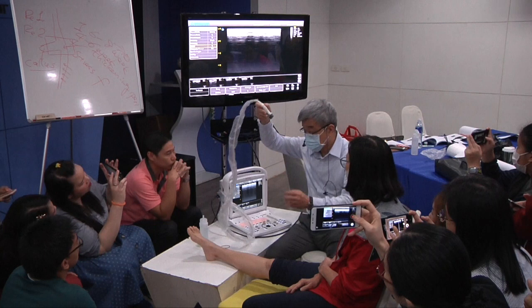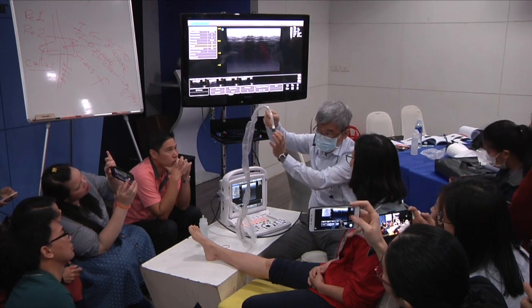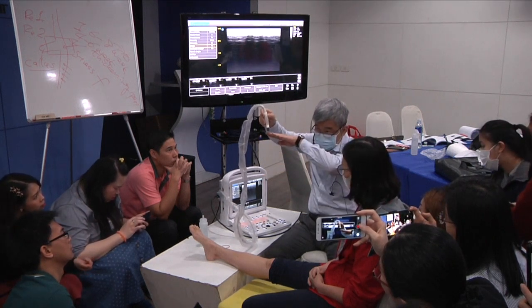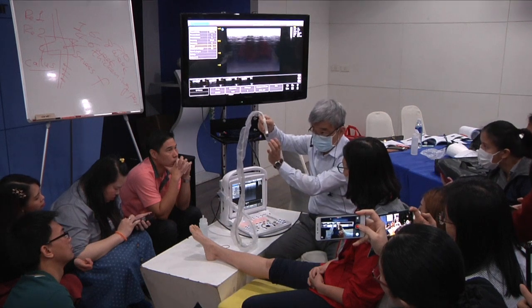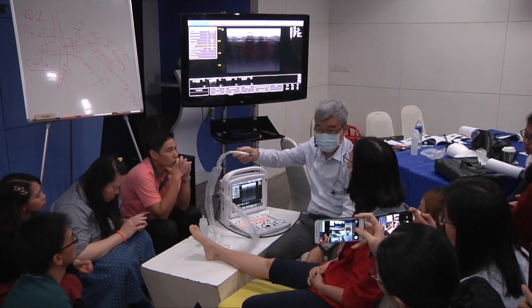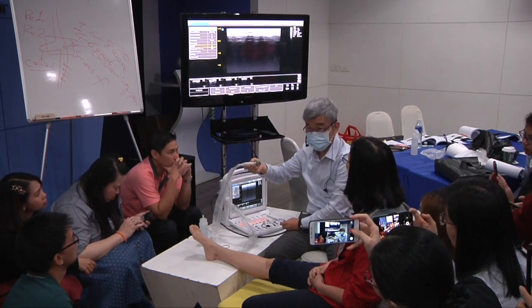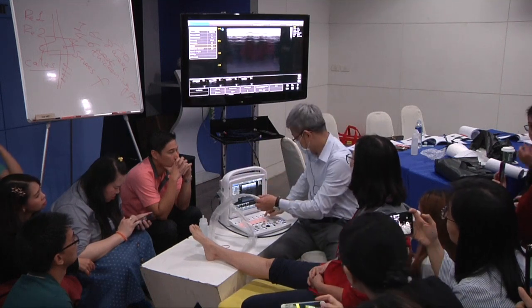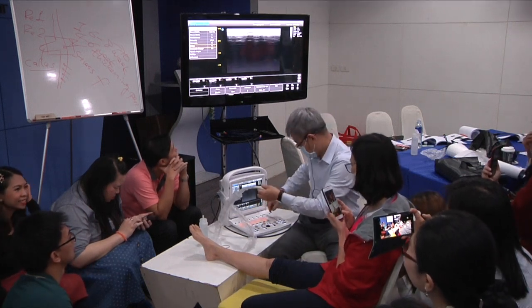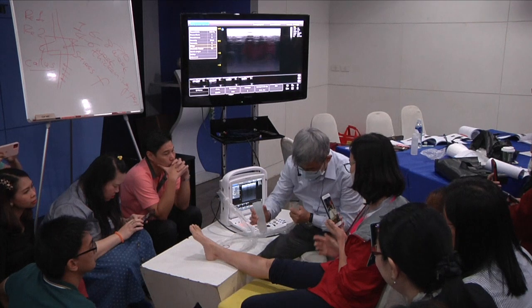The compound function, basically the sound wave is transmitted in this way. The compound function means sometimes the sound wave transmits in this way, sometimes it transmits in this way, so for better edges of structures. But with proper skill of heel-toe walking, you don't need compound functions. But it's okay, depends on you. Okay, good. Ready?